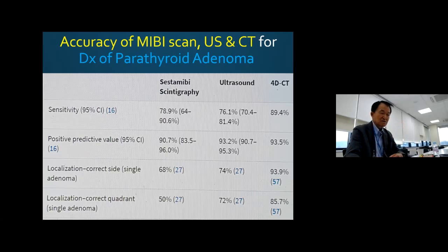It's because this is a millimeter resolution. We usually use 0.64 or sub-millimeter slices, less than 1 millimeter, very thin sections. So that makes a lot of radiation. The 4D, not 3D, 4D: arterial phase, and then capillary venous phase.